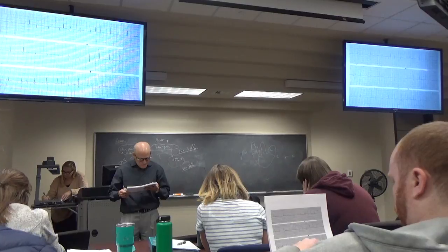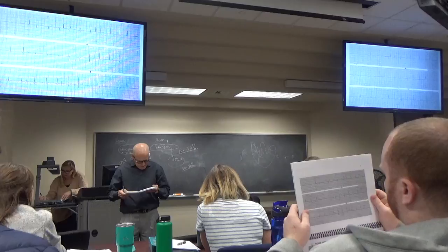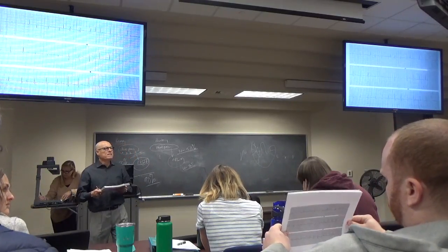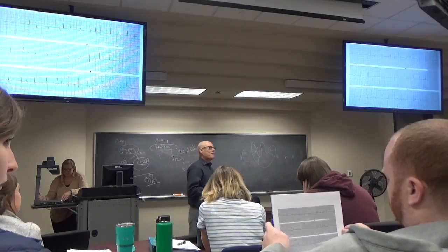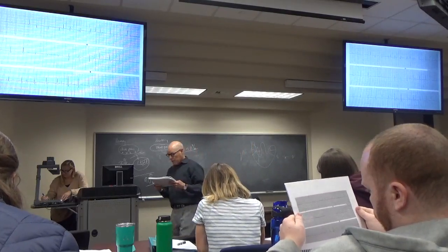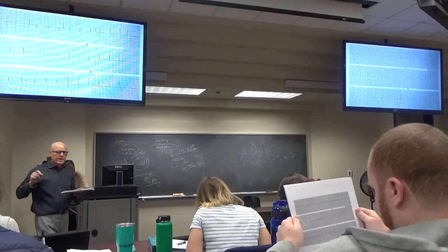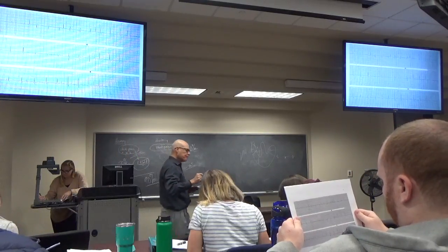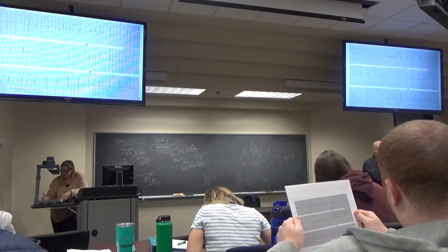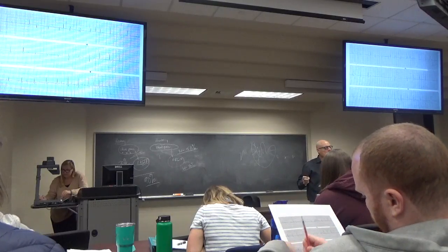I tried to look at a few different ones, and that was an average I got. How many found a wide QRS in the limb leads? You can only count them in the limb leads, remember? I didn't know that. So if you're counting it in V1, yeah, it's too wide. I can't find a QRS in the limb leads that says 0.12 or greater.